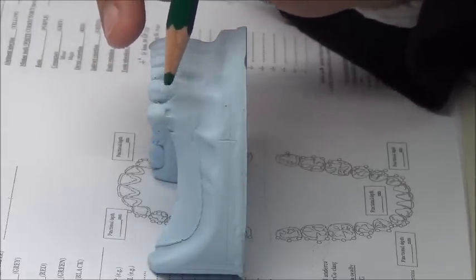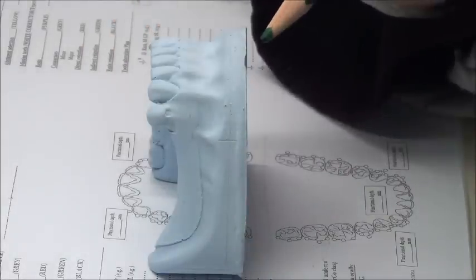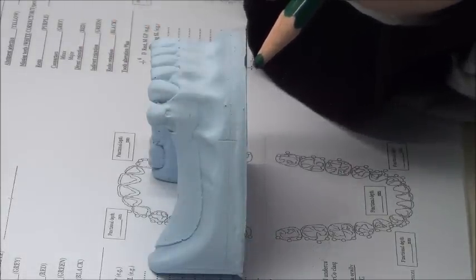Right? Okay, proximally, mesial or distal, it depends on the clasp once more. Where am I going to put my clasp? If it's an I-bar, I prefer it to be in the mid-facial, slightly mesial. This is the area of option. What will happen if I have it close to the saddle area? Distal undercut, I begin to think.